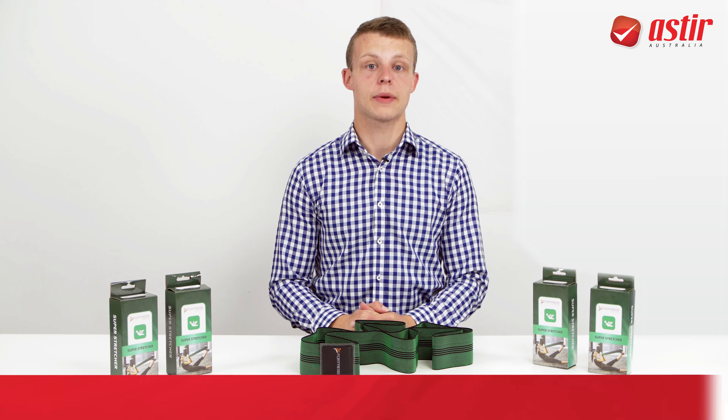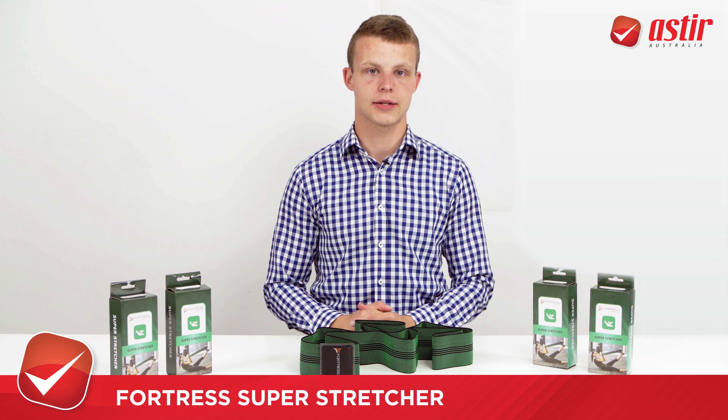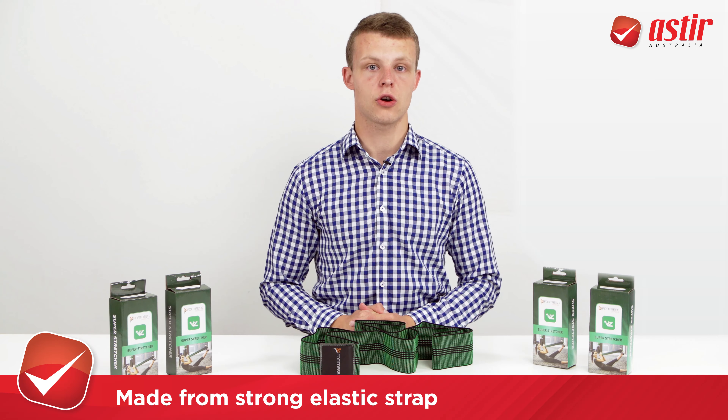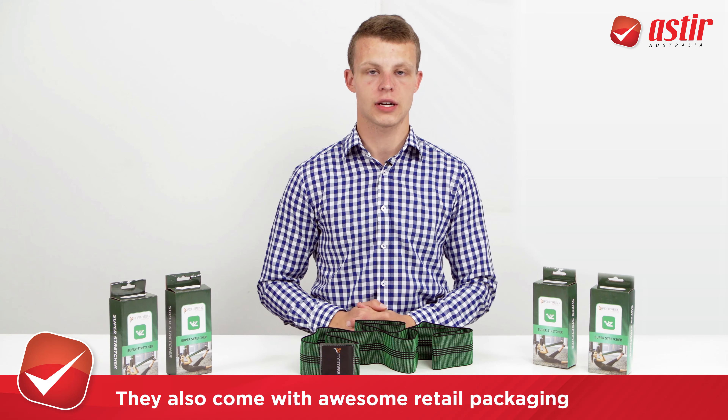Hello, my name is Paul and I'll be talking about the Fortress Super Stretcher. These are a ripper product. They are made from strong elastic strap. They come in awesome retail packaging for you to resell in your clinic.